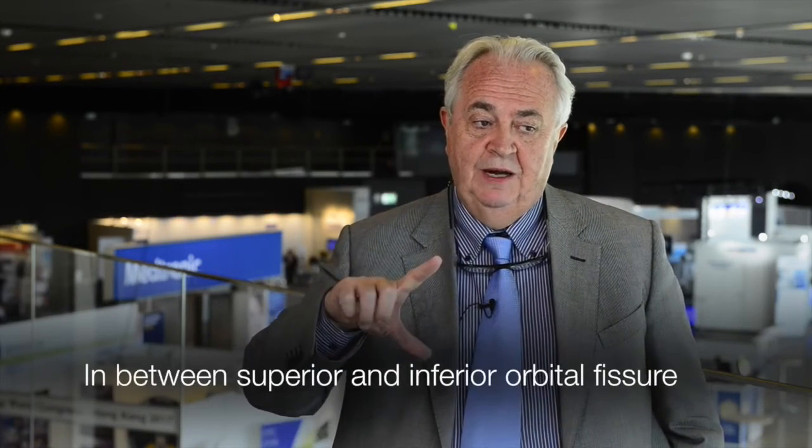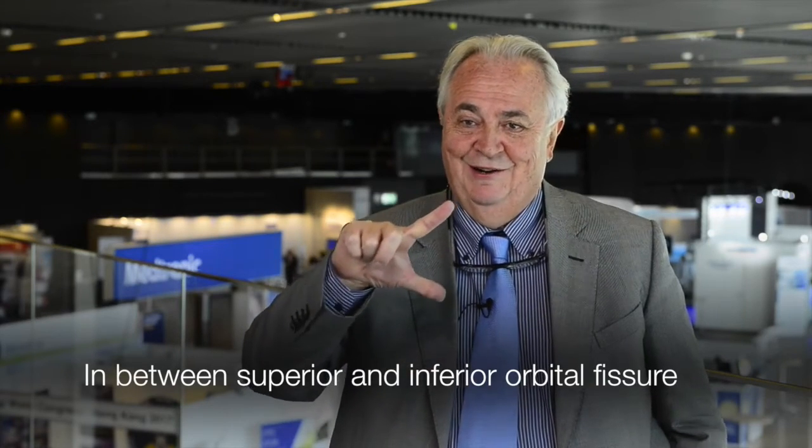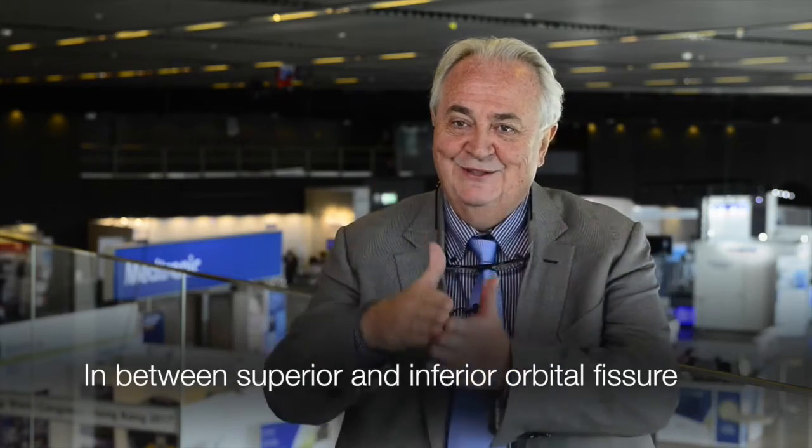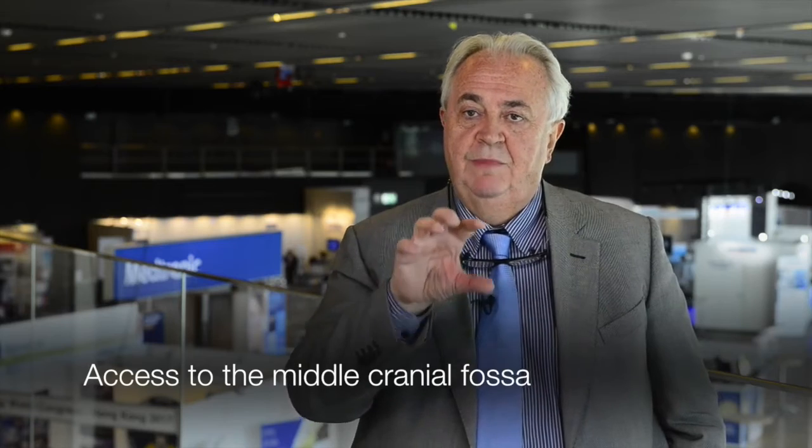When we are inside the orbit, we know that in between the superior orbital fissure and inferior orbital fissure, which are very clear because the periorbit goes inside, there is the greater wing of the sphenoid. And removing the greater wing of the sphenoid, we have access to the middle cranial fossa, to the floor.